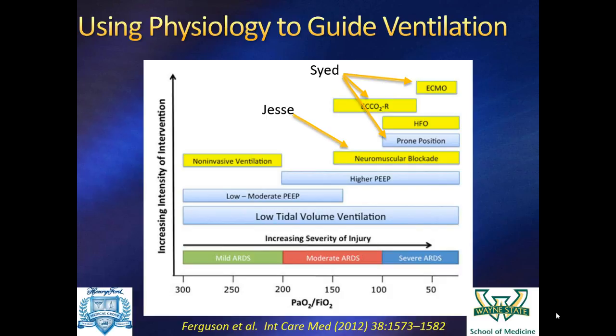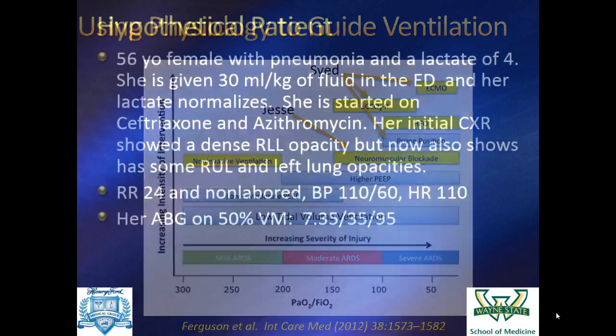So I'm really going to concentrate on the ventilator and on oxygen, and not really talk about rescue therapies as much. I'll talk about APRV because that fits. But I'm not going to be talking about what you do when those techniques don't work. I'll really be limiting myself to this. And we'll start, as makes the most sense to me, with non-invasive ventilation.